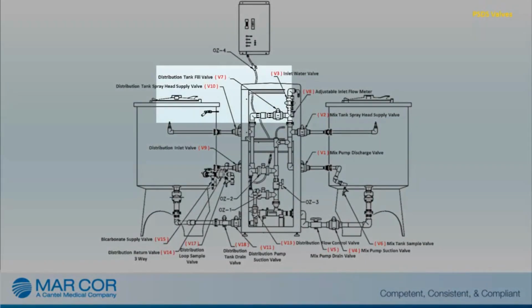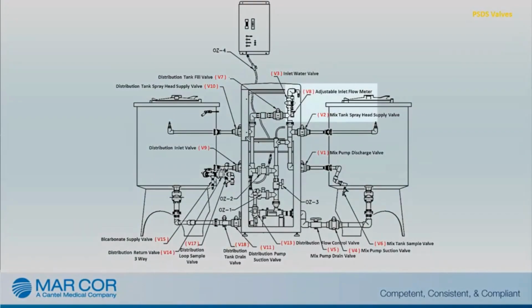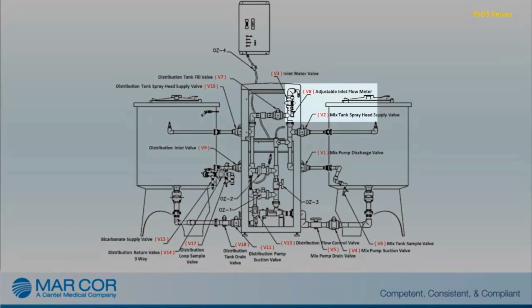When opened, V7, the distribution tank fill valve, allows for the transfer of solution from the mix tank to the distribution tank. When adjusted, V8, the adjustable inlet autofill flow meter, regulates the fill rate into the mix tank.